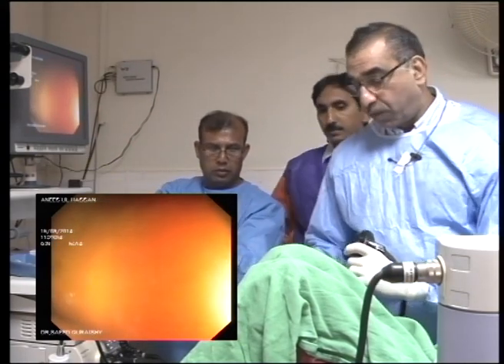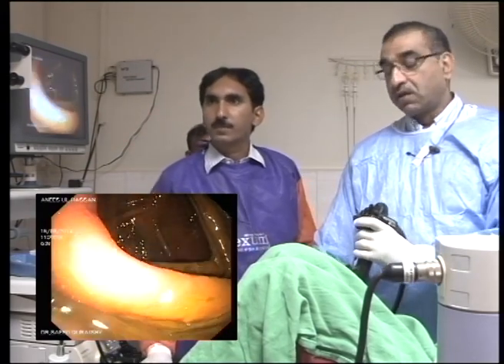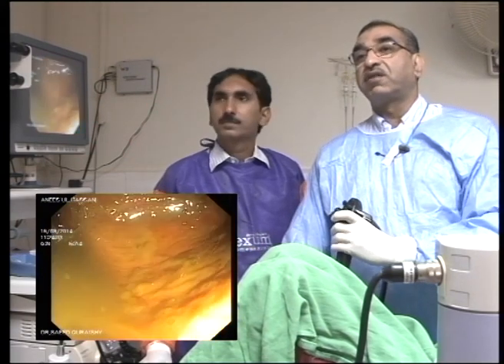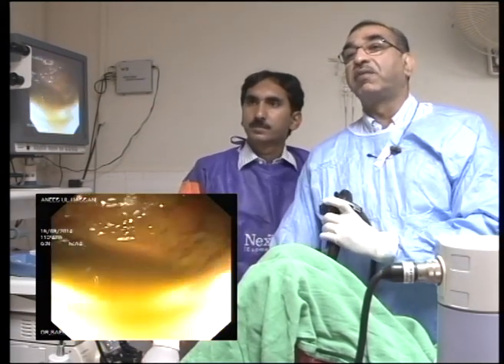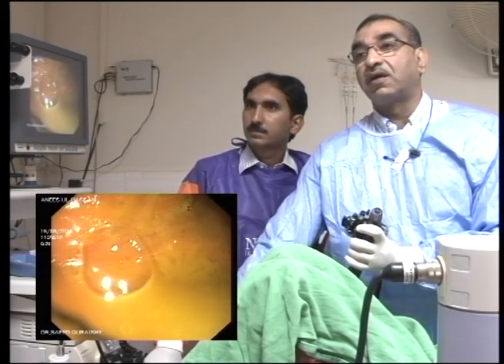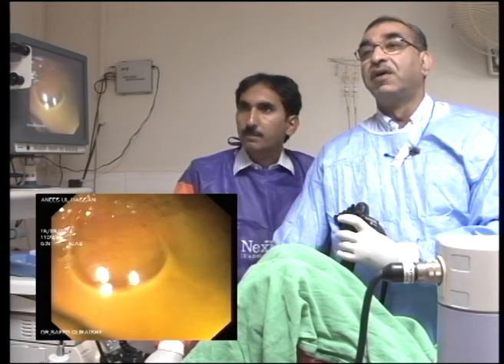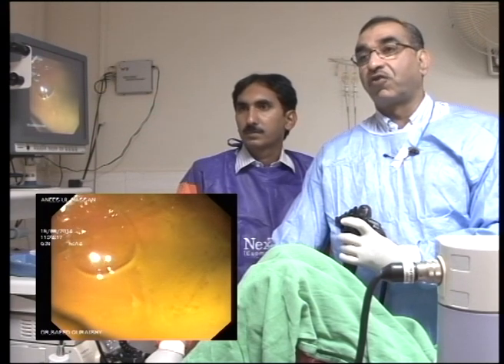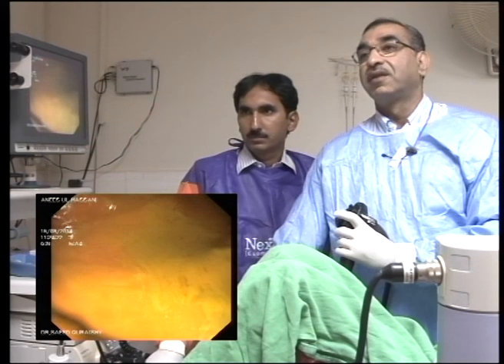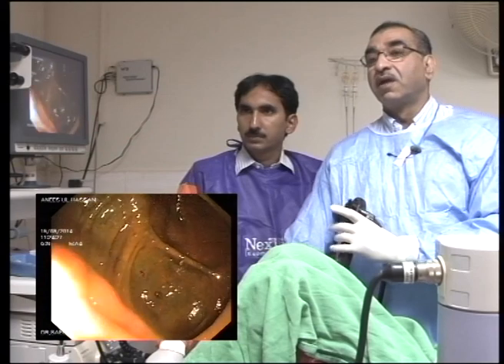Okay, so now the important part of the examination is taking the scope out, right? Normally, if you are sucking the fluid off, bring it to 7 o'clock, 5 o'clock position and suck like that, as if you are sucking up the last bit of Coke with a straw from the Coke bottle without causing that slurping noise, so it doesn't collapse the lumen, and that's how you do it.